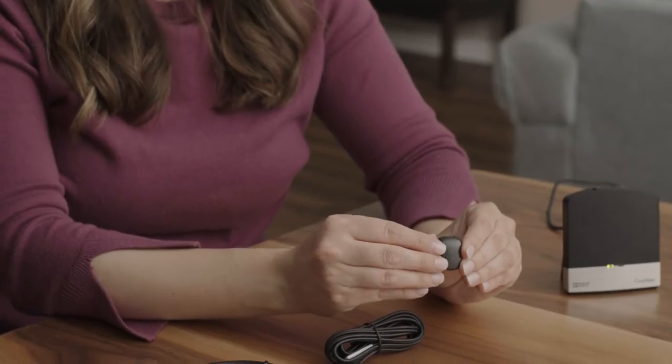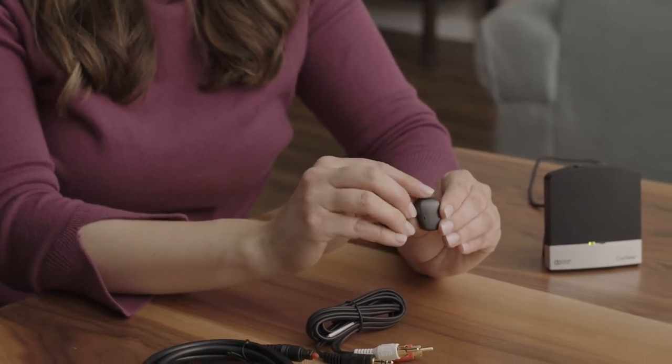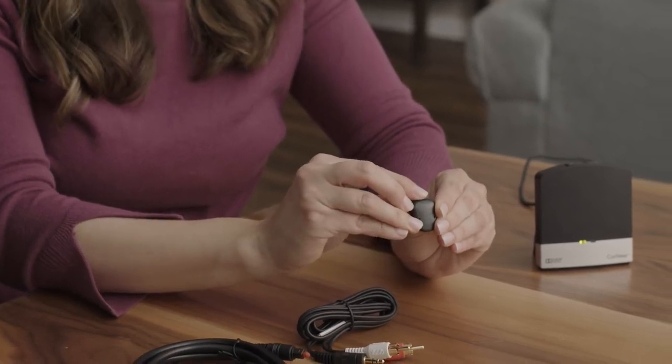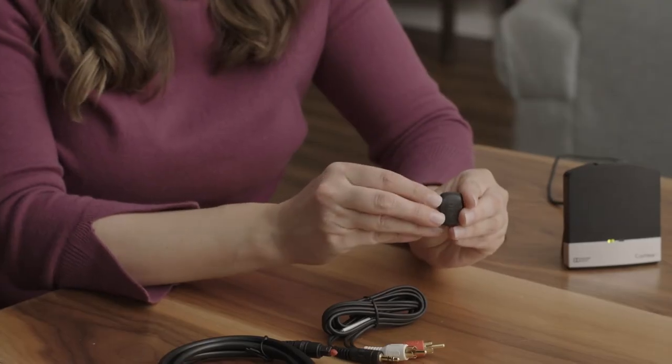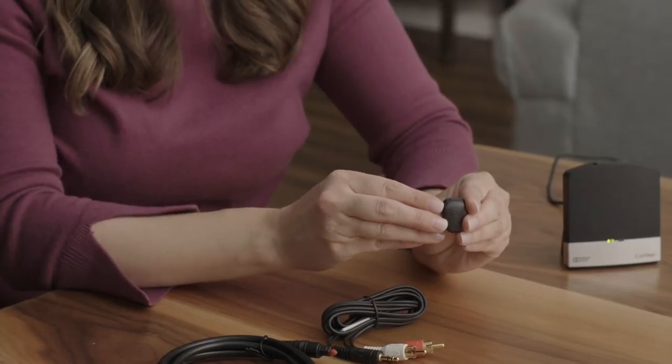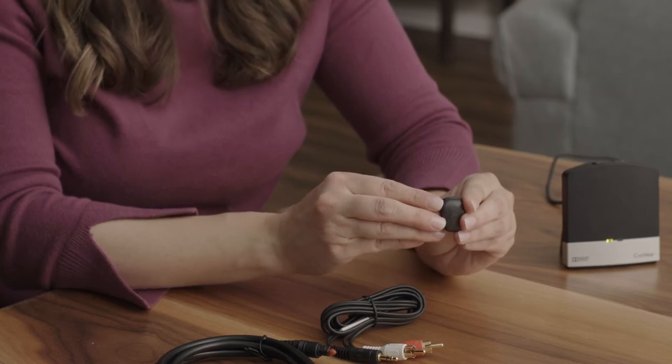To start streaming from the TV to your sound processor, press and hold the button on the top of your sound processor until you hear ascending beeps. To stop streaming, press the button on the top of your sound processor one time. You should hear descending beeps through the sound processor to indicate streaming has stopped.